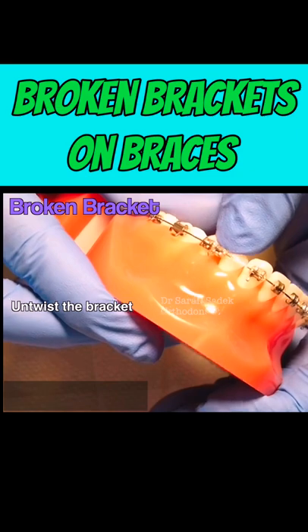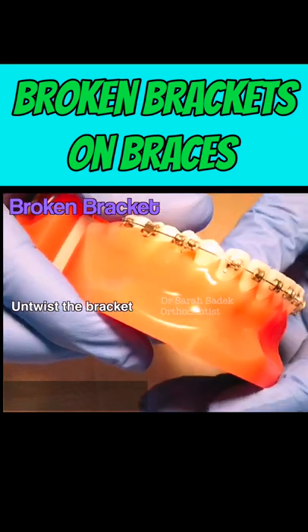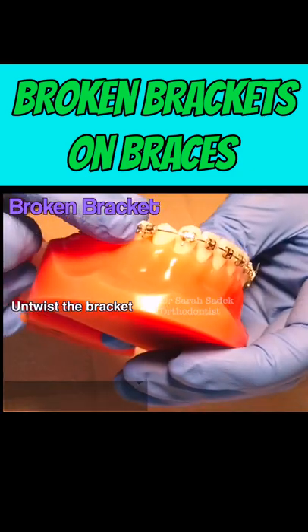You can check this by looking in the mirror and untwisting the bracket back to its normal position to ease the discomfort.